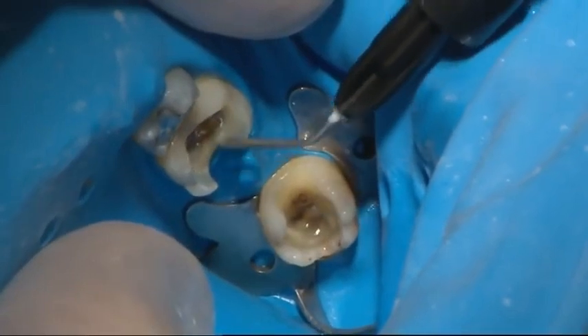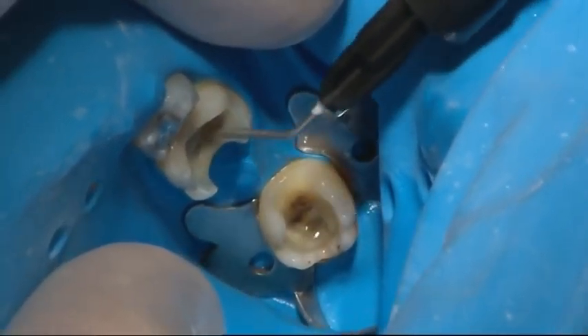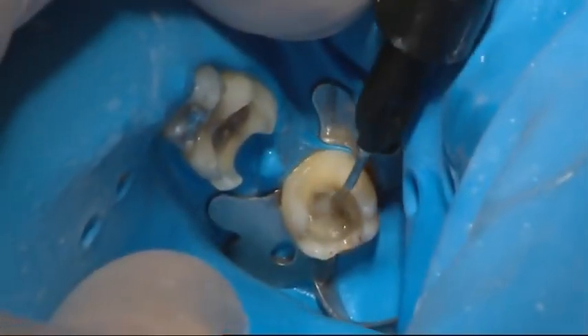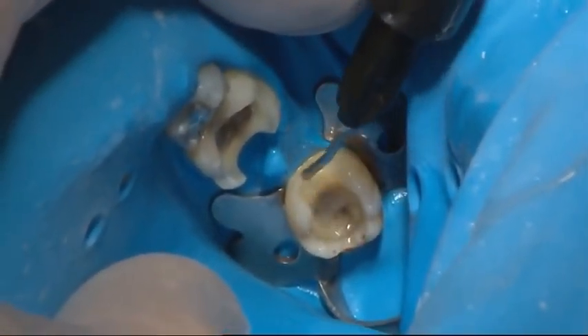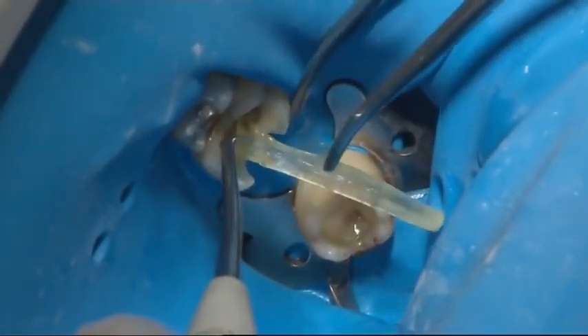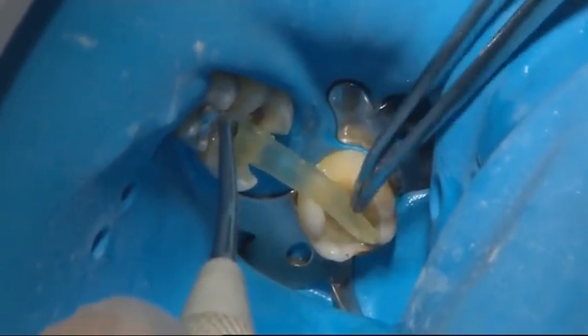A layer of flowable composite was applied onto the bonded teeth surfaces. The first fibre layer was placed on top of the uncured flowable composite and light cured for 5-10 seconds through the silicone adapter.